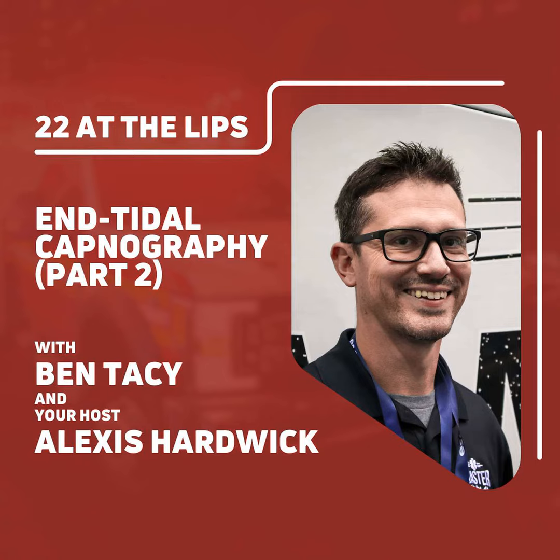Then, if we want to look at the waveforms of everything, imagine that waveform. If it goes up real quick, straight up, that means all the CO2 in your body has, boom, come out right now. If it's coming up as a gradual curve, as that shark fin, that means the volume of air you're exhaling, because CO2 is in that same volume of gases we're exhaling. So if it's slowly detecting CO2 coming out, that means there's an issue with the exhalation process.